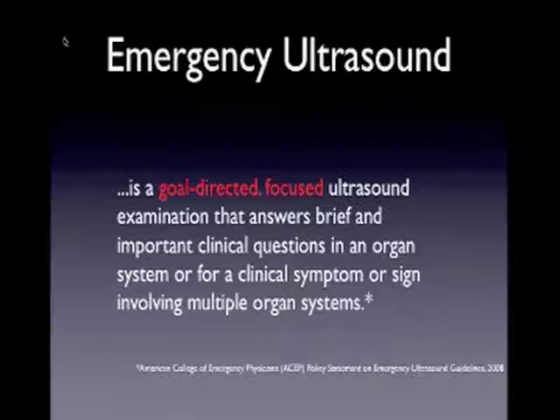So what is emergency ultrasound? As quoted from 2008 ACEP's policy statement on emergency ultrasound guidelines, emergency ultrasound is a goal-directed examination that answers brief and important clinical questions in an organ system or for clinical symptoms or signs involving multiple organ systems.